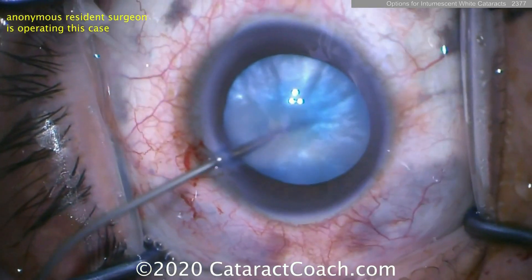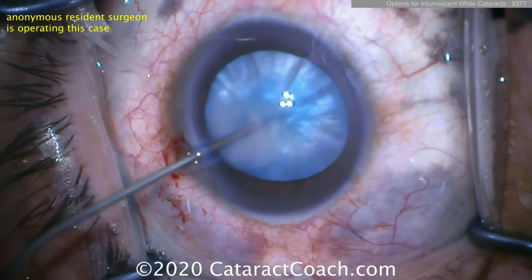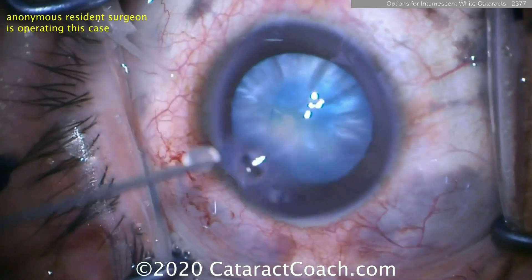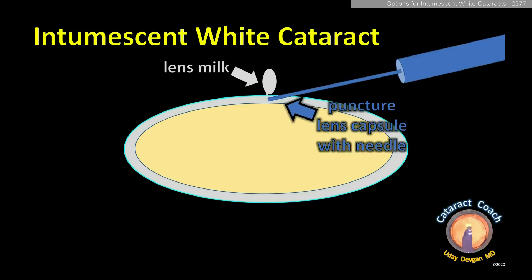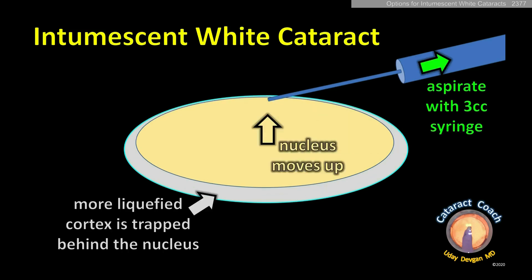Now what we can do is rotate it around, rock it back and forth to release more — look at that, more milk came out. That milk is the liquefied lens cortex. So again, liquefied cortex surrounds the denser nucleus. Once you make a puncture here, you'll get some of the lens milk out and you can aspirate it, but then you need to rock the nucleus.